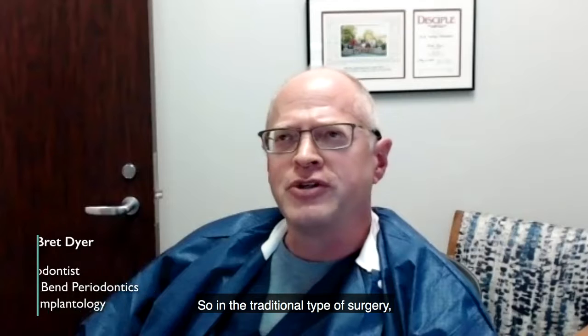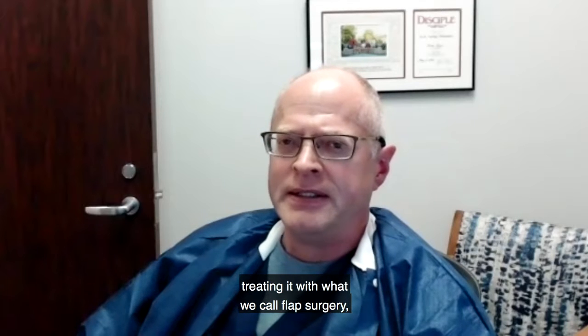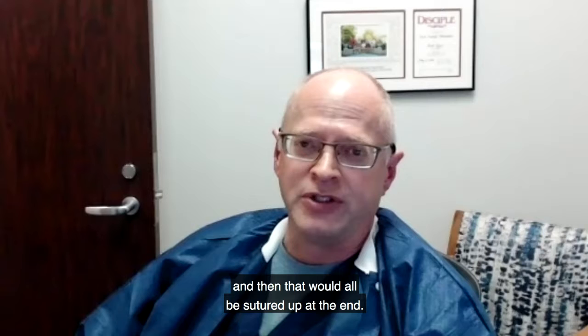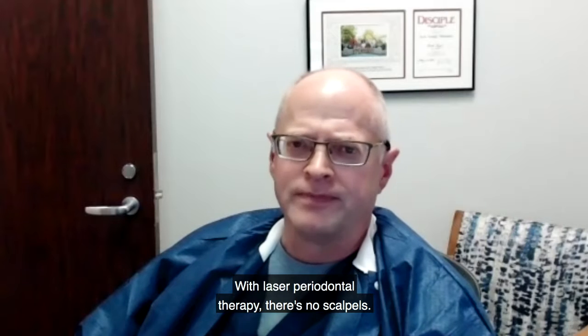In a traditional type of surgery, if you had gum disease and they were treating it with what we call flap surgery, they'd use a scalpel to make incisions and clean out the infection, and then that would all be sutured up at the end. With laser periodontal therapy, there's no scalpels.